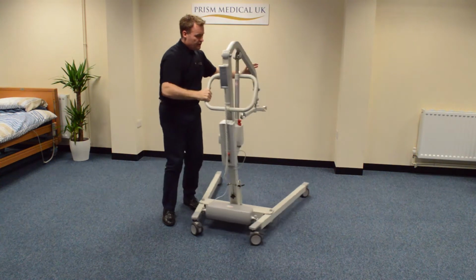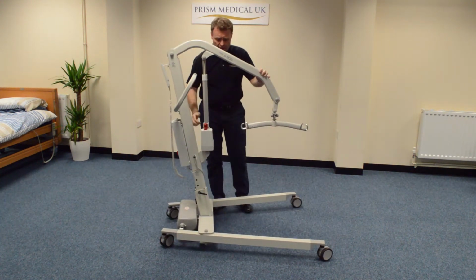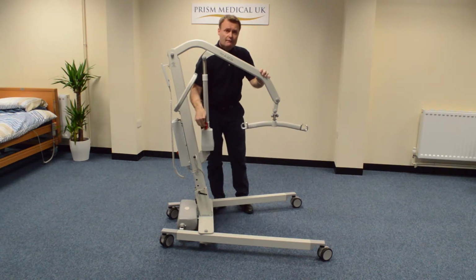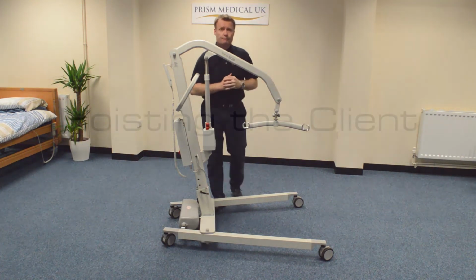On this particular hoist, the actuator has a manual emergency lowering facility. Simply by pulling on the red lever there, with the weight of the client on there, the carry bar will lower slowly, get them back into the chair nice and safe.